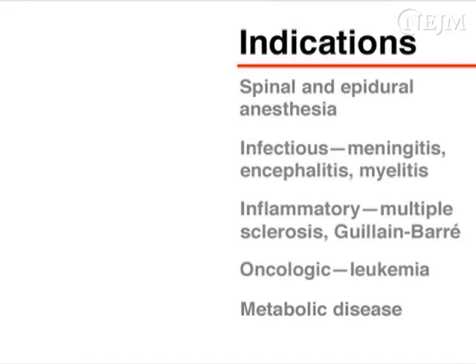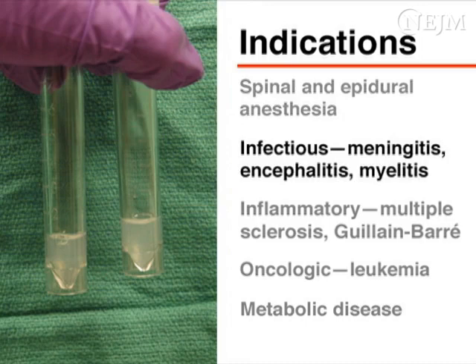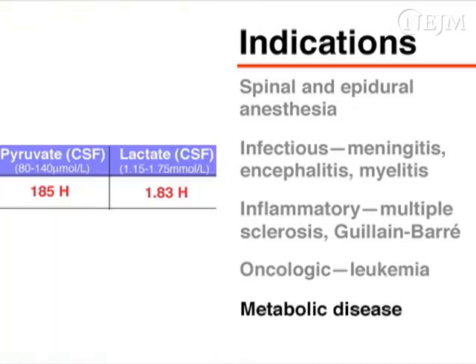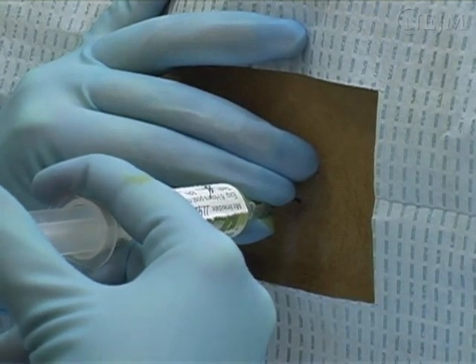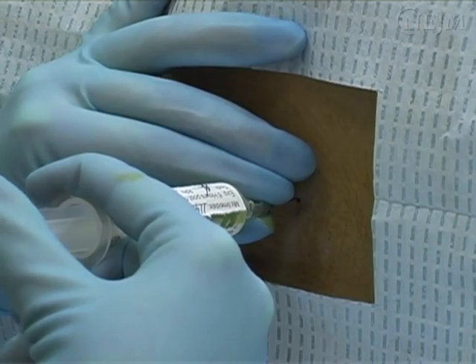Lumbar puncture is indicated for both diagnostic and therapeutic purposes. Also, the administration of spinal and epidural anesthesia involves essentially this same technique. Analysis of cerebrospinal fluid may be helpful in the diagnosis of infectious processes such as meningitis, inflammatory diseases such as multiple sclerosis, cancers such as leukemia, and metabolic processes. Therapeutically, lumbar puncture allows for the intrathecal administration of chemotherapeutic agents and antibiotics.